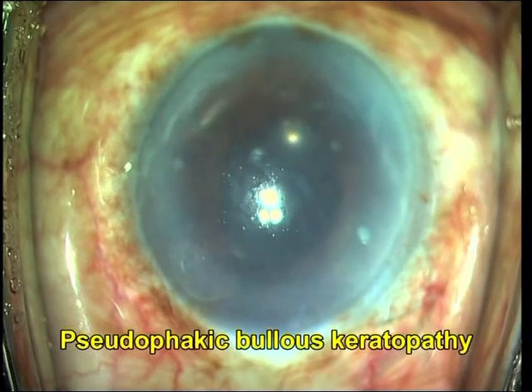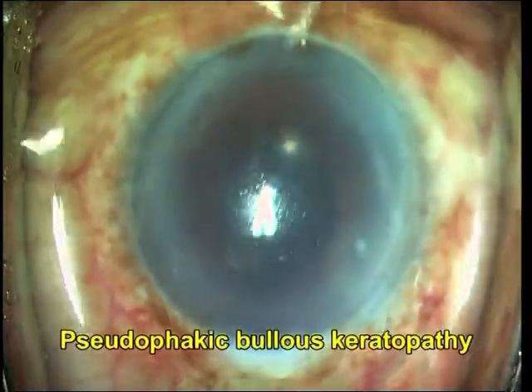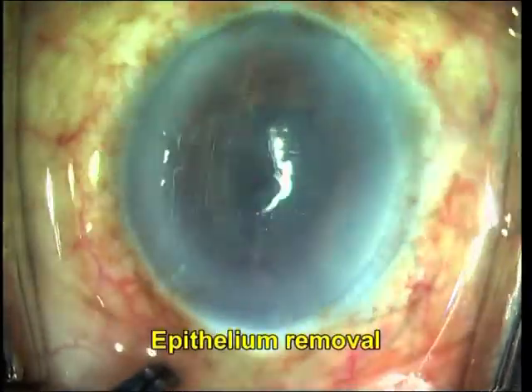The graft is then stored in MK medium. This is a case of pseudophakic bullous keratopathy posted for PDEK.